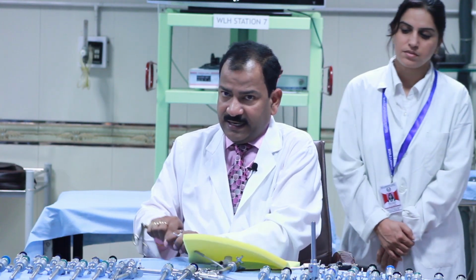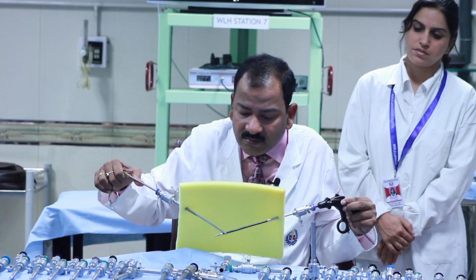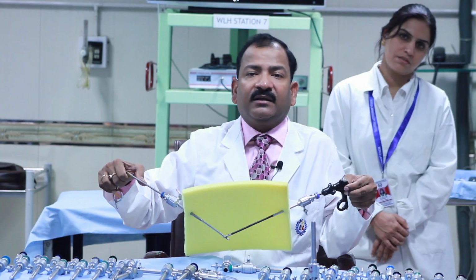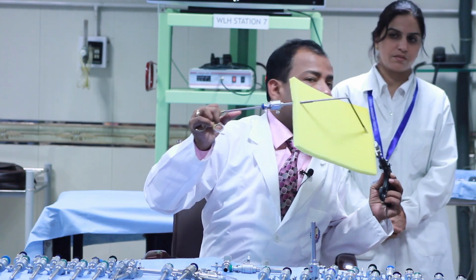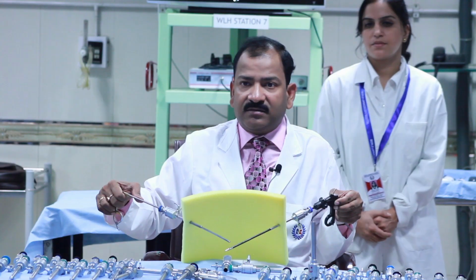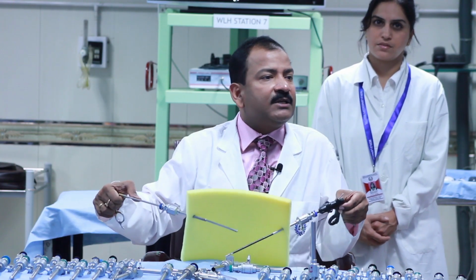This is one instrument here, and now you see with both these instruments my manipulation angle is approximately 120 degree. Can you see that? See this angle. This is not even 90, it is 120, isn't it? This is 120, because the uterus will not move and my port will also not move. It is not open surgery where I can change the manipulation angle.